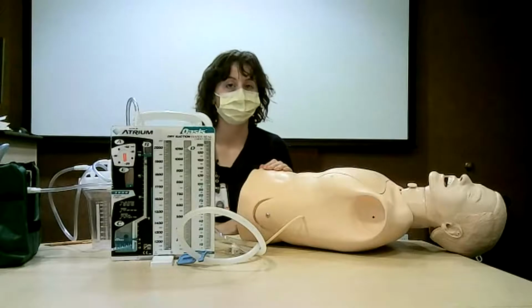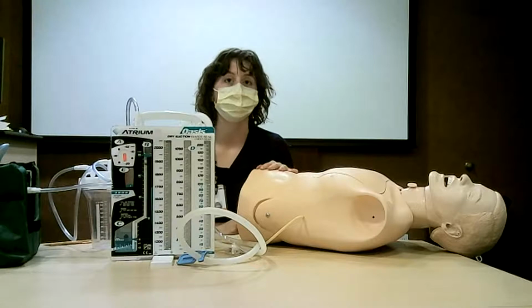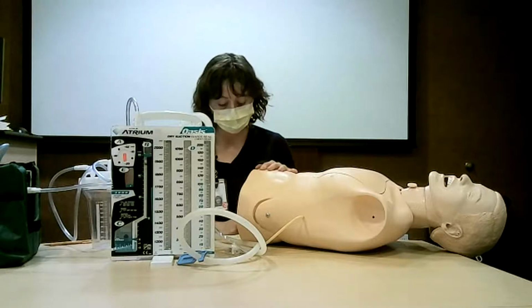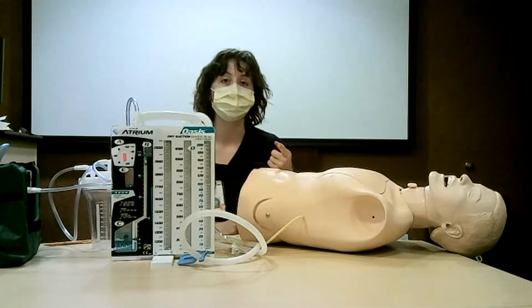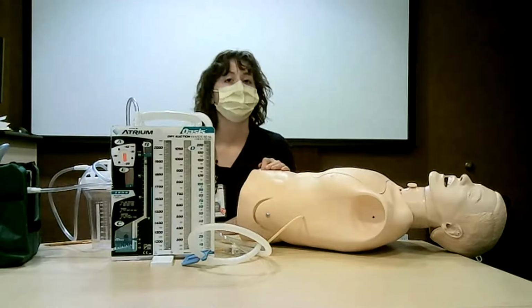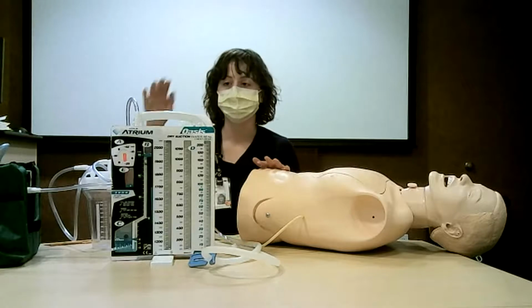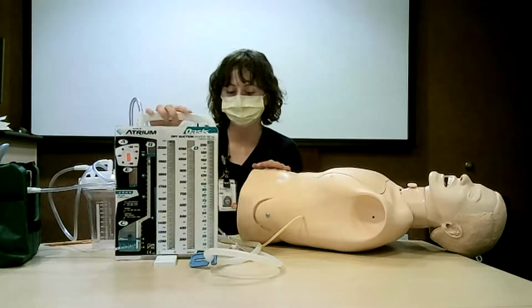When you are going in to conduct your assessment of your patient with a chest tube, the first thing you want to do is check the doctor's orders. They will either state to put the chest tube to suction, to water seal, or to clamp it. Note as well how much suction the surgeon would like the atrium to be set at.